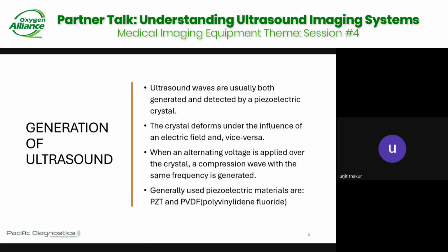So then we have the generation of the ultrasound as well. The ultrasound waves are both generated and detected by the piezoelectric crystal within the transducer. The crystal itself deforms under the influence of an electric field and vice versa. Vice versa meaning when the sound wave propagates within the body and comes back, it deforms again.